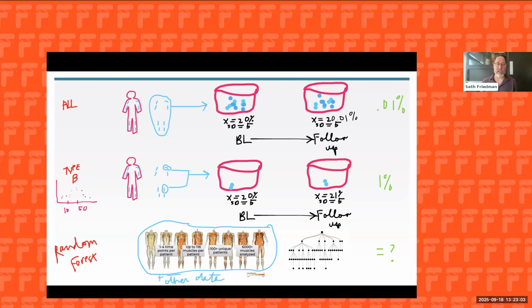The other thing you can see in my little drawing in the center on the left is that there are a lot of red dots that are not included in the pot. And so we're really leaving out a lot of muscles, and there are muscles changing within those red dots that we're going to ignore. So this approach suffers from treating all muscles the same and not including things that might actually have important variance.